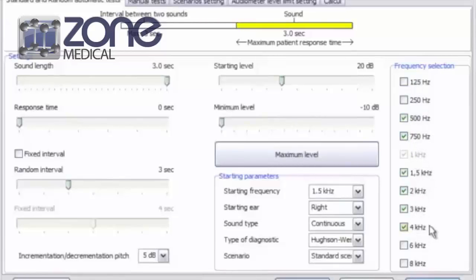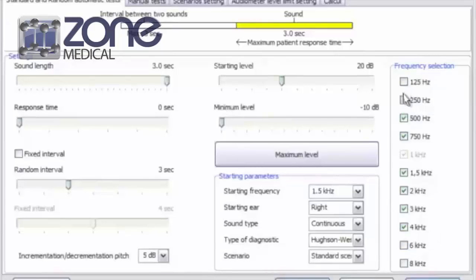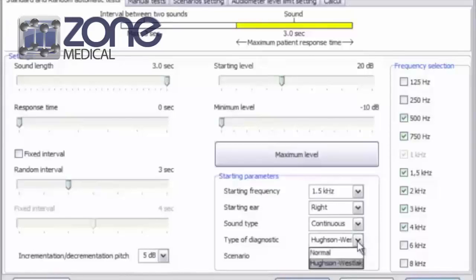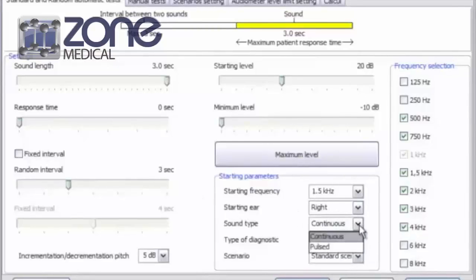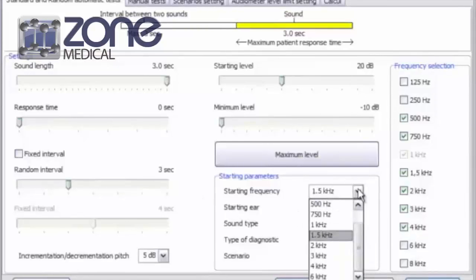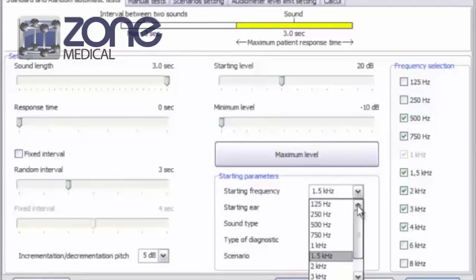They will be on by default, but I've already taken them off. You can also change the type of diagnostic. I find that this one is the preferred style. You can also change the sound type from continuous to pulse, or adjust the starting frequencies.